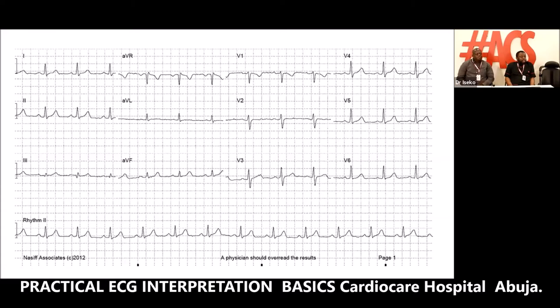Okay, once again, is there a QRS after every P wave? Look at the rhythm strip. So in every ECG, you will see that strip at the bottom. That is one long strip for reading. That's how you do it. So is there, after every P wave, a QRS? Yes. Before every QRS, is there a P wave? Yes. So what rhythm is this? Normal sinus rhythm. Okay.